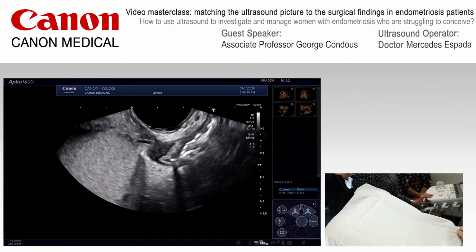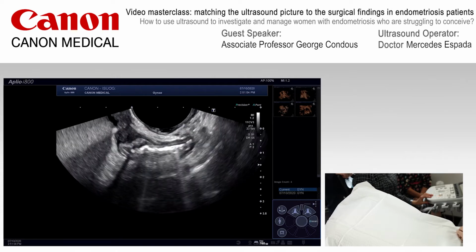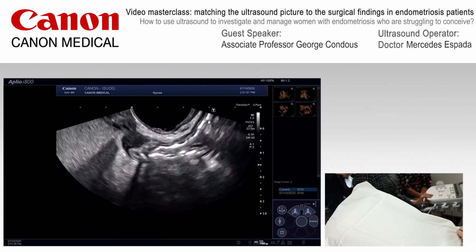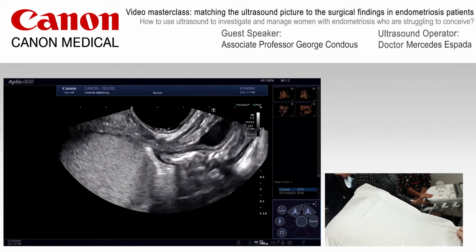This is a 23-year-old young woman who's had significant symptoms in relation to bowel pain, dyschezia, no rectal bleeding for the last year to 2 years, but on questioning her in greater detail, she's actually had symptoms for quite a while. So when the scan starts today, the probe's been inserted into the anal verge, and we followed the muscularis in a cephalic direction. And one of the first things that we come across on the ultrasound scan itself is we can see that there is indeed a rectal nodule that's present.